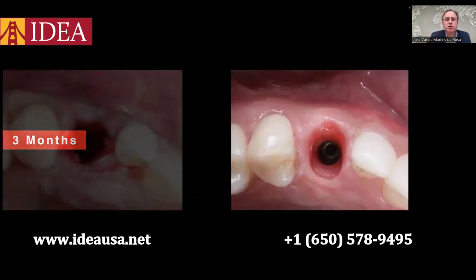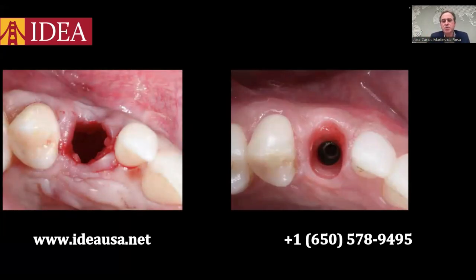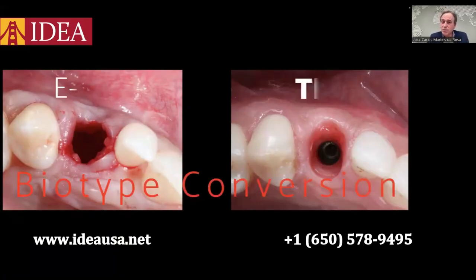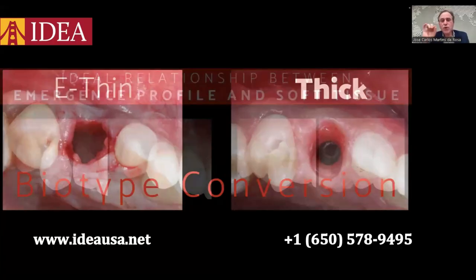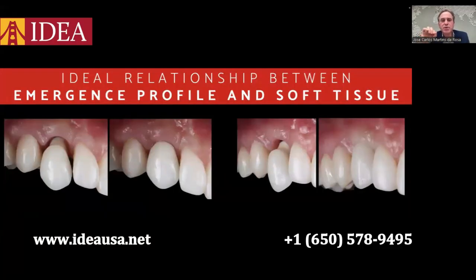If you make a comparison with the day of the surgery and before, here I would like to share with you one more example of the biotype conversion. We had in the beginning an extremely thin periodontal biotype, and now you can see a thick periodontal biotype. So let's focus on the ideal relationship between the emergence profile and the soft tissue.